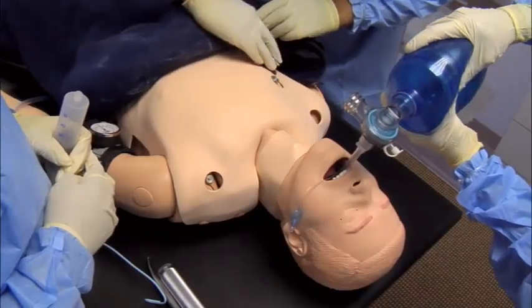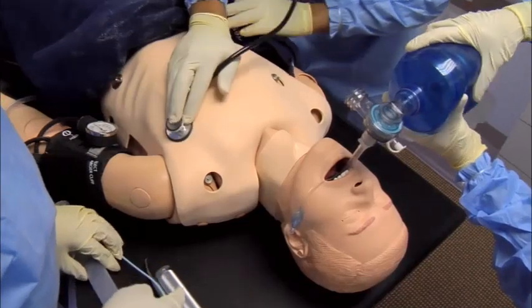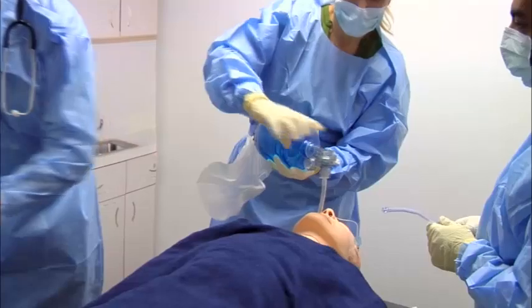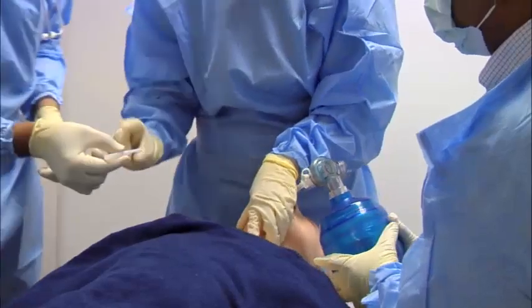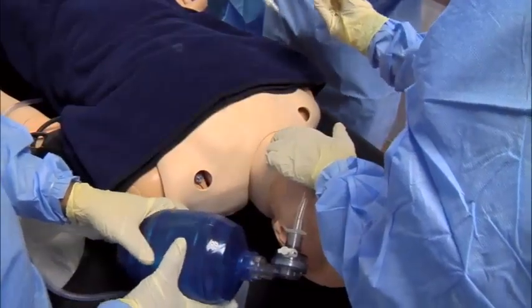I still don't see any chest rise. Do you hear breath sounds? There's no breath sounds. Okay, let's prepare for a surgical airway. Please get the cricothyrotomy kit. After 1 to 3 unsuccessful attempts to intubate the patient, consider a surgical airway. A cricothyroidotomy or tracheostomy can be rapidly completed in an emergency situation.